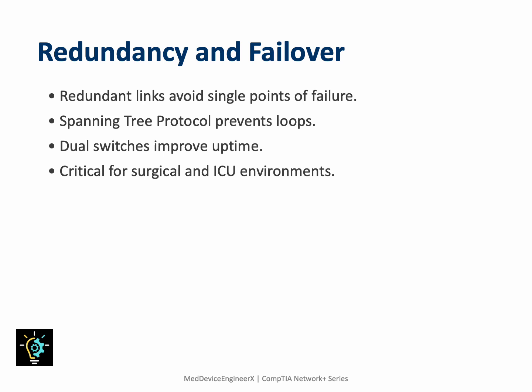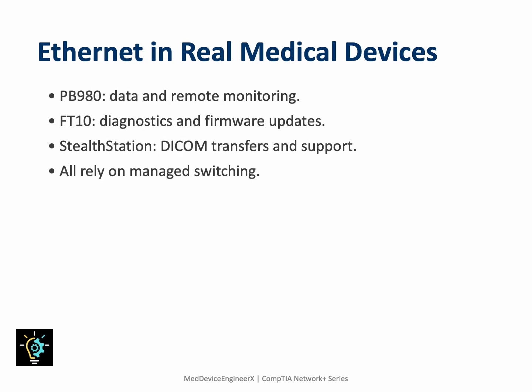Hospital networks use redundancy to ensure reliability. For example, surgical systems like the StealthStation S7 may connect through dual network paths to maintain data flow even if one link fails. STP prevents loops, keeping backup paths on standby. This design minimizes downtime, a non-negotiable in patient-critical environments.